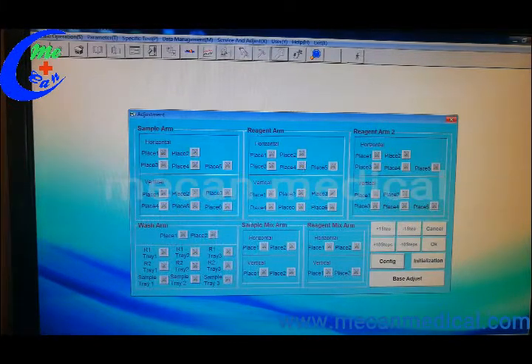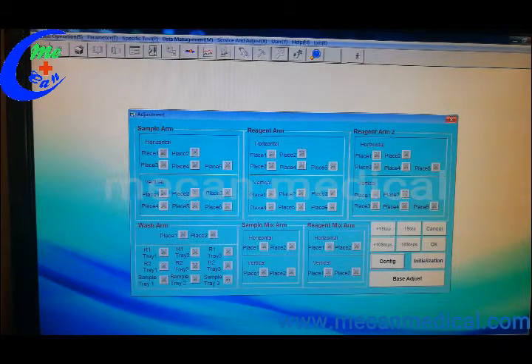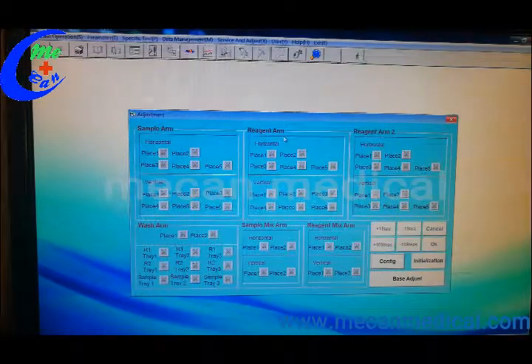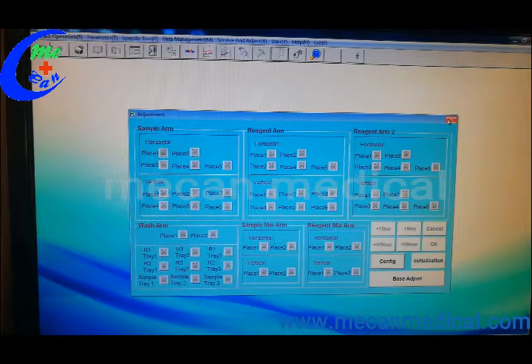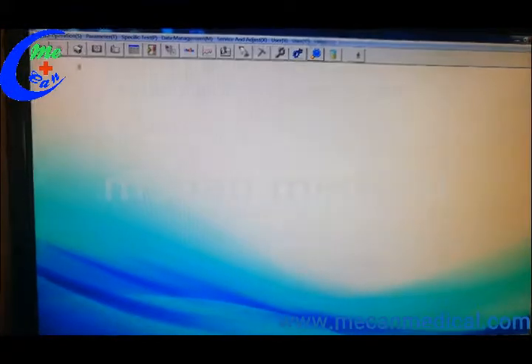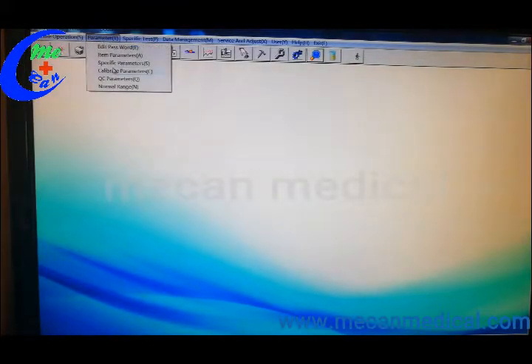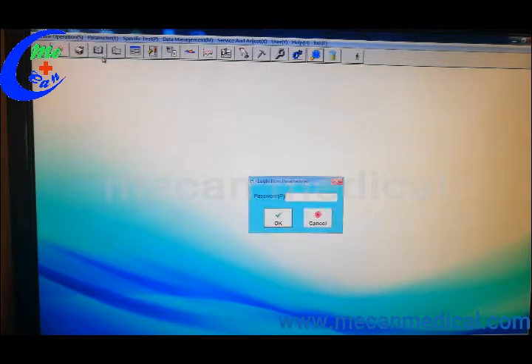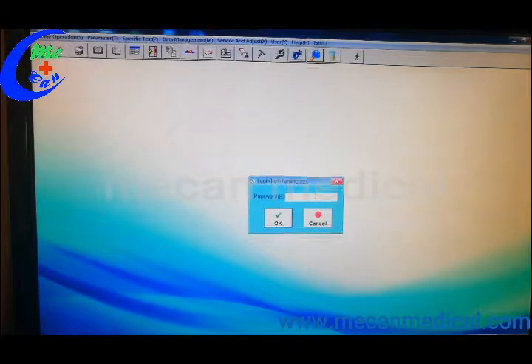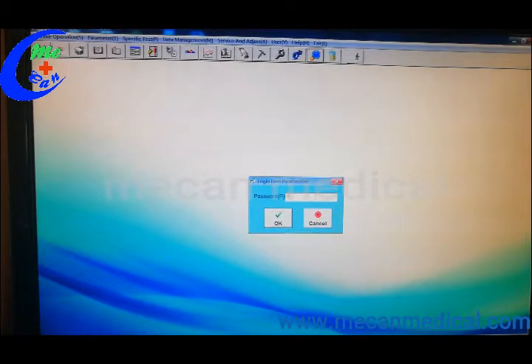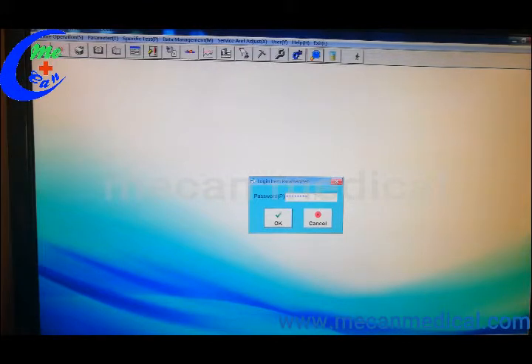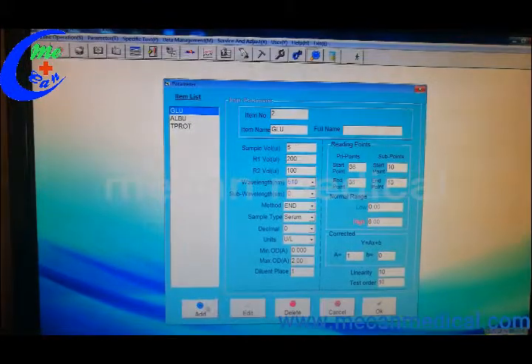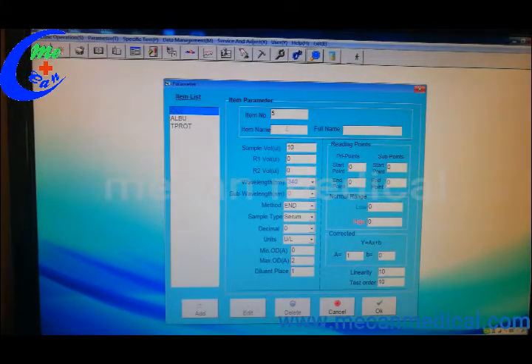It will show you which arms you will use. And then you should go for the item parameters. Item parameter password is 8 times 0: 1, 2, 3, 4, 5, 6, 7, 8. Add from here.